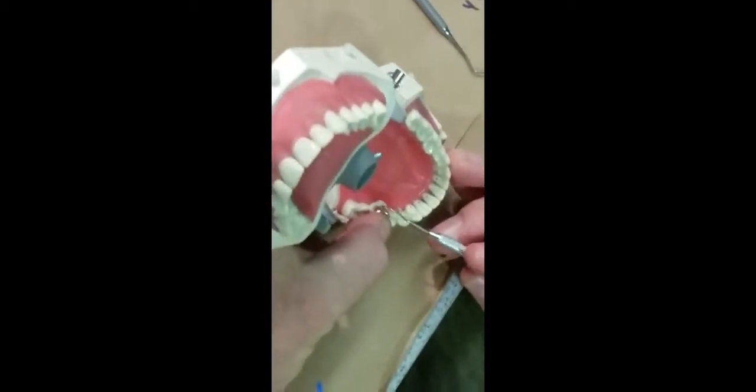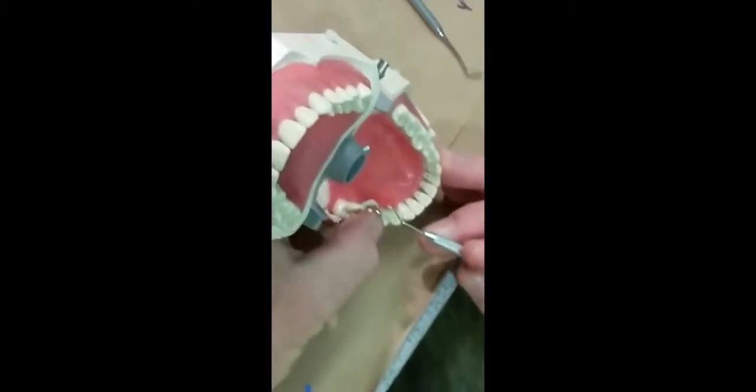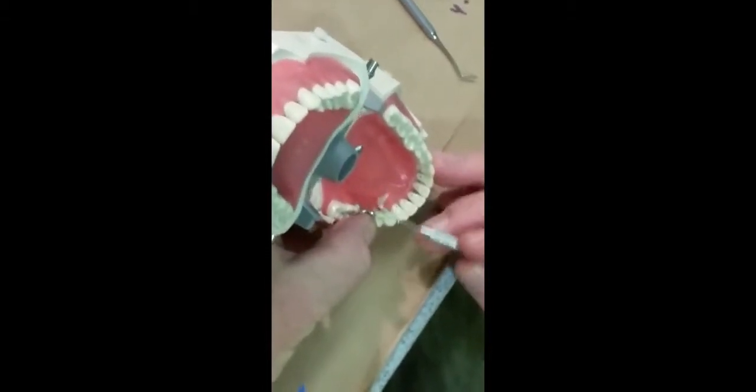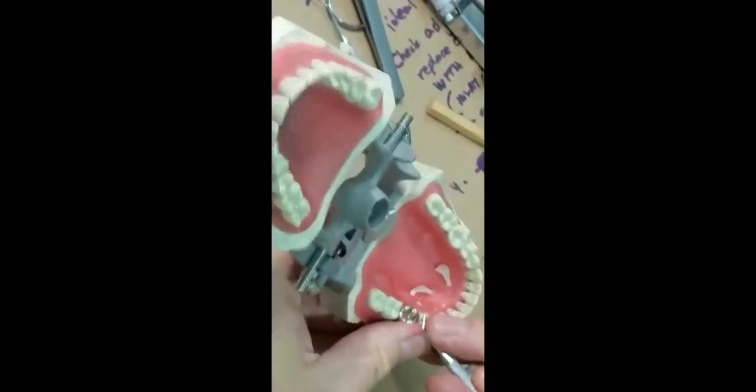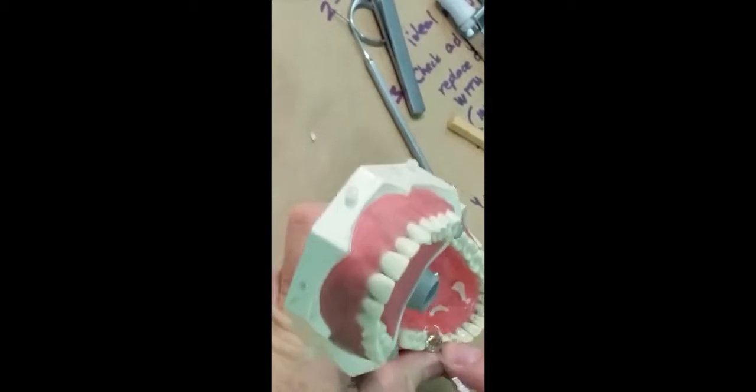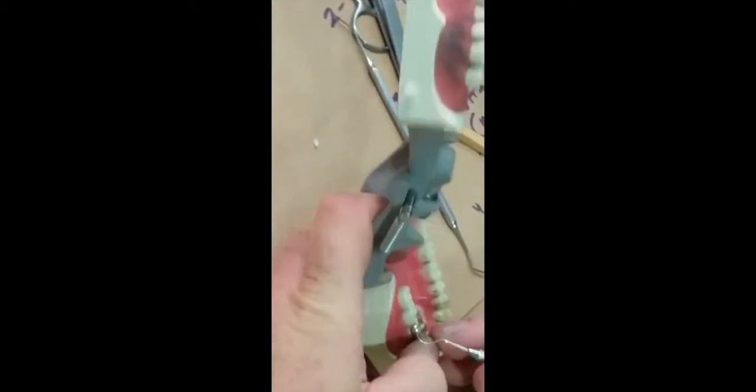When it gets to this kind of rubbery or flexible stage, that's when you want to peel it off of the tooth — buccally and lingually — and then push it through the proximal. Just take your floss and push it through. If it won't go through, pull it out to the buccal, pull it out to the lingual to get rid of the bulk of it, and then push through.